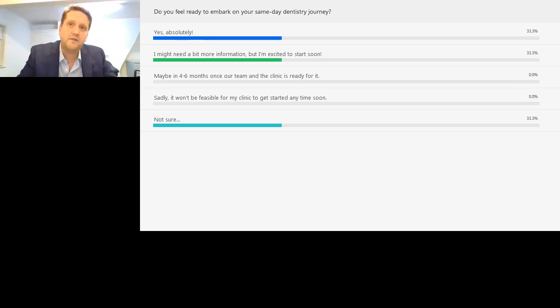And again, to some extent that comes down to setting up the insertion direction in the right place in the first instance. When you're looking, it might be set in a certain position with the fewest undercuts or what have you, but actually when you look at it and set it from the view, you get a slightly better idea of where that insertion direction should be, and then you can set it with better contact.